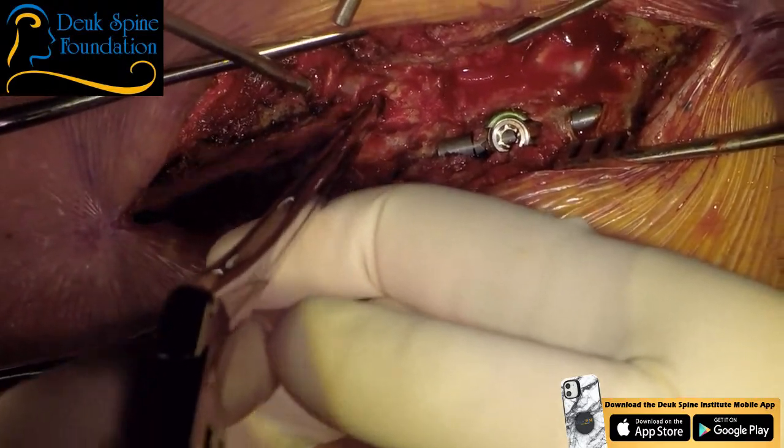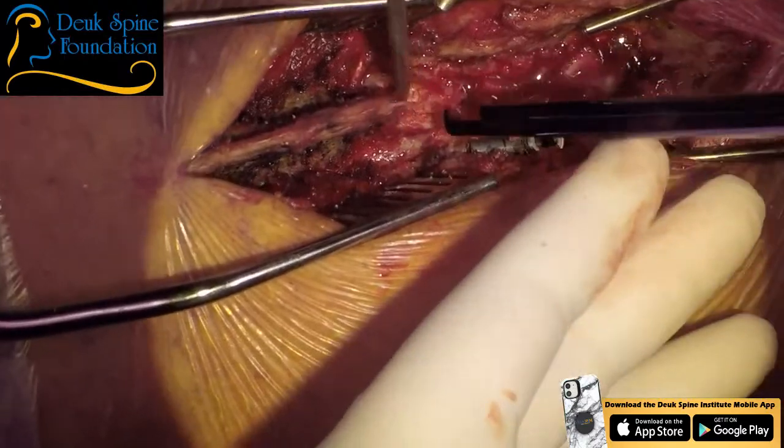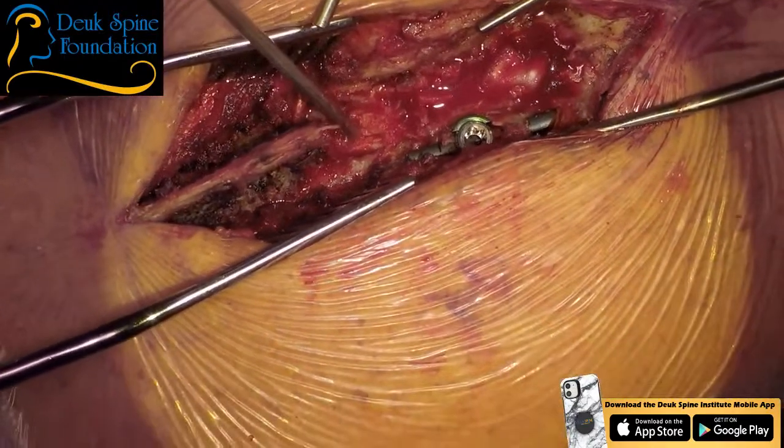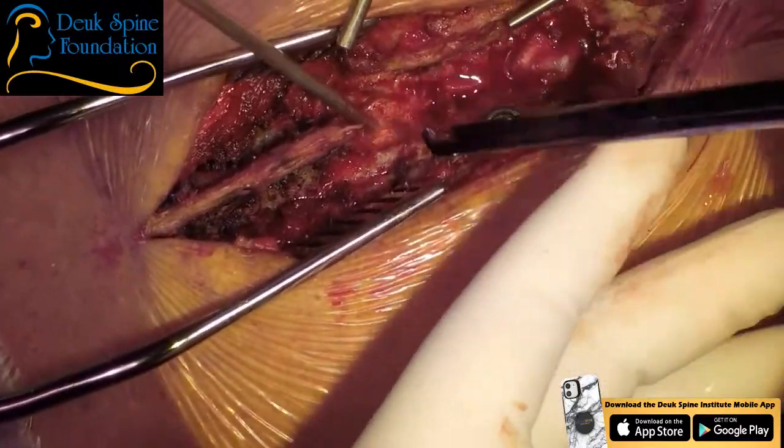glove. You want to find a plane between the bone and the spinal cord. That's the key. And scar tissue will make that plane disappear.